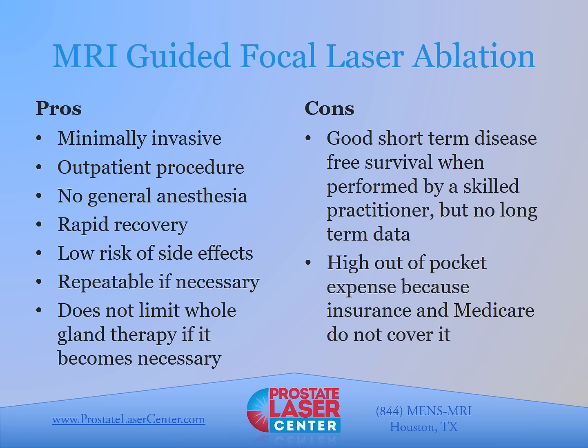MRI guided focal laser ablation, I believe, fulfills a need between whole gland therapies, which tend to be very traumatic, and active surveillance, which means no actual treatment of the cancer. This option is minimally invasive. It's an outpatient procedure, no general anesthesia. Patients have a rapid recovery. There's a low risk of side effects.